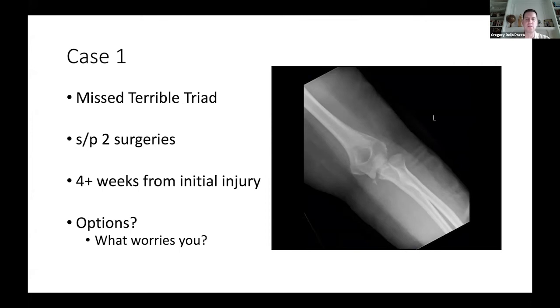I know that the internal brace is a proprietary name by one of the companies that makes it. But the idea is that it's basically a suture tape that is designed to reinforce or substitute for the absent lateral collateral ligament.